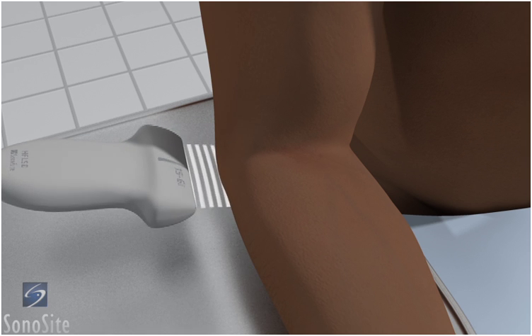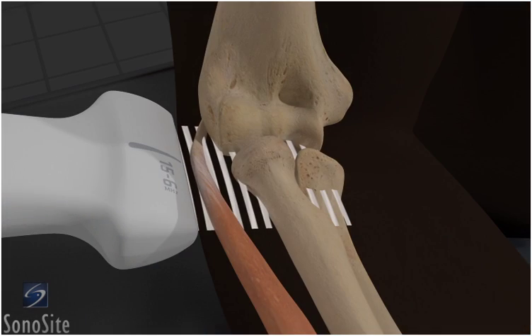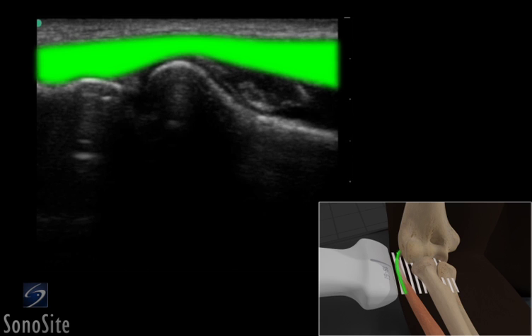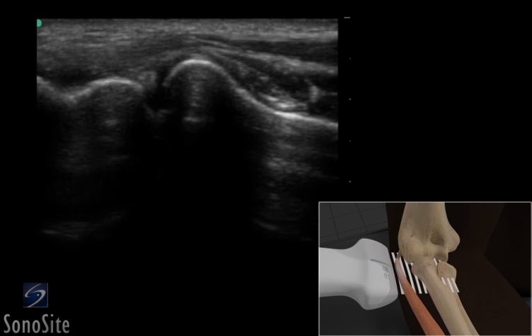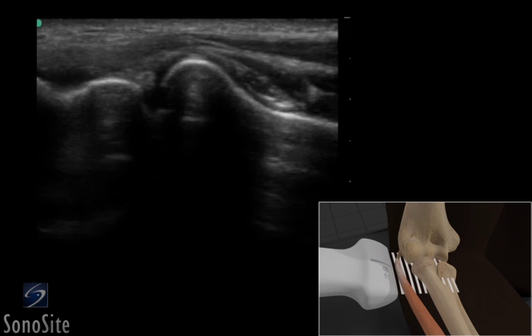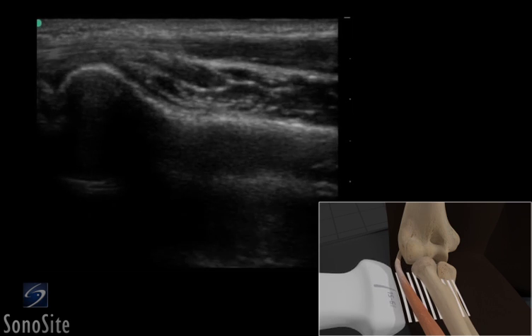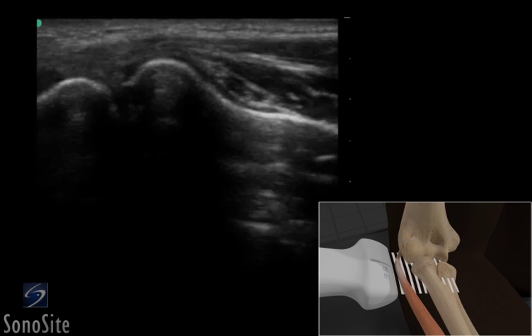The transducer is placed over the proximal forearm in a longitudinal fashion with the orientation marker directed toward the patient's head. The lateral epicondyle and rounded radial head are seen as bright, hyperechoic lines. The extensor tendon can be seen as a hyperechoic fibrillar structure that inserts on the surface of the epicondyle. Joint effusions can be seen in this view just deep to the extensor tendon. The transducer should be moved slightly down the arm to evaluate the tendon for calcifications, tendinosis, or discontinuities associated with injury.